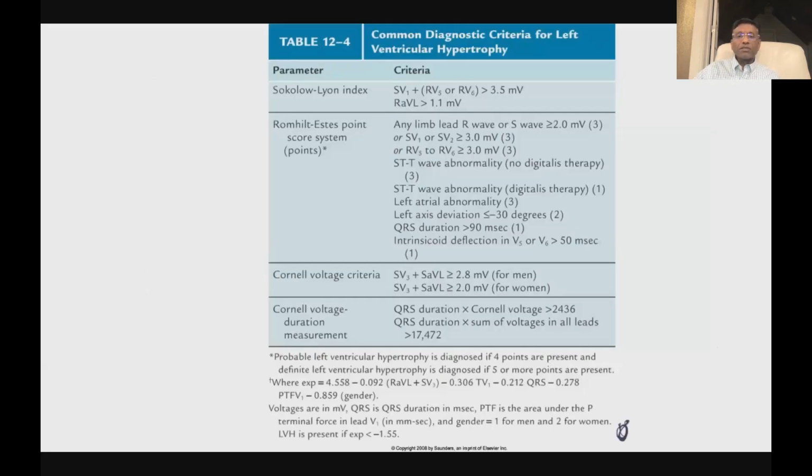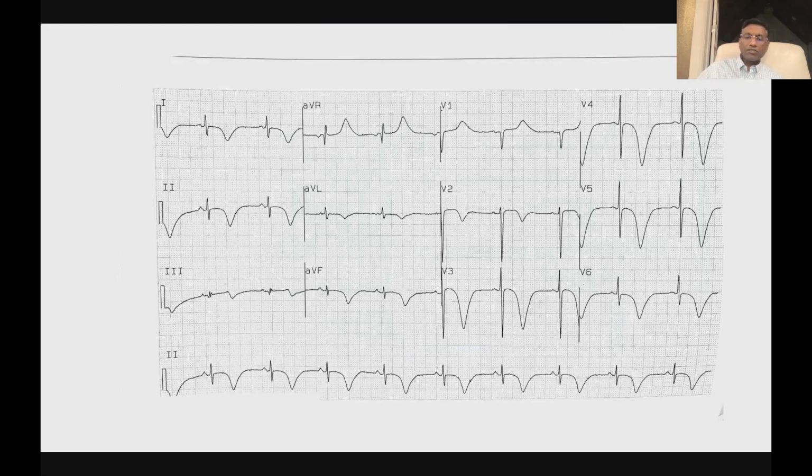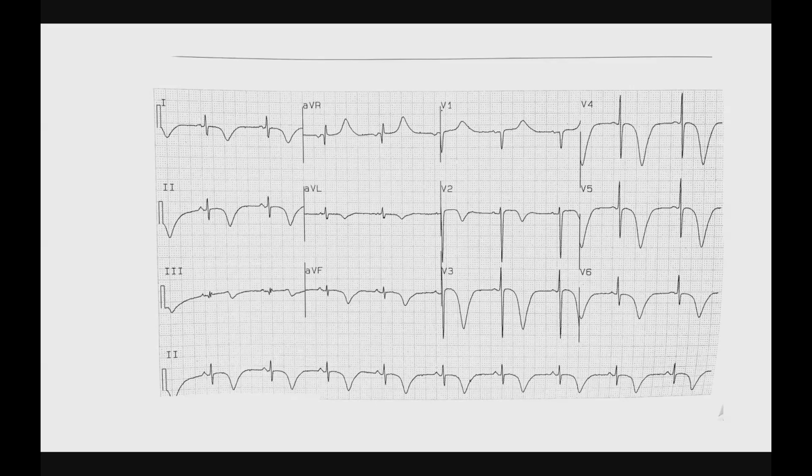Actually, let's go to, okay, let me see here. Yeah, let's take this one and then we can come back to more of those rhythm EKGs. Any takers here? Usagre, can you take this?